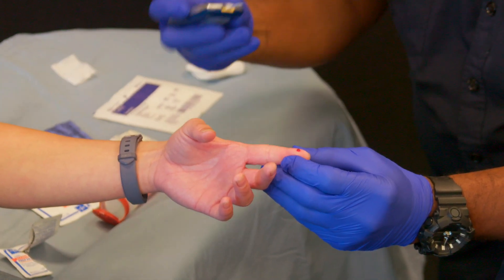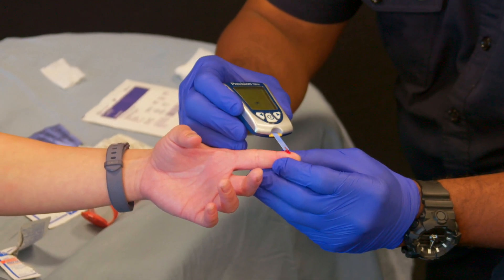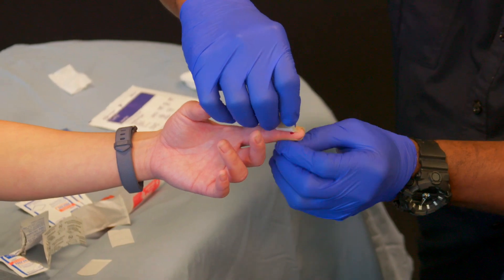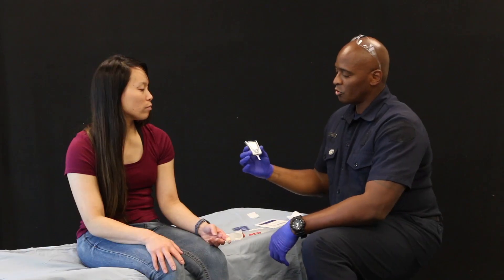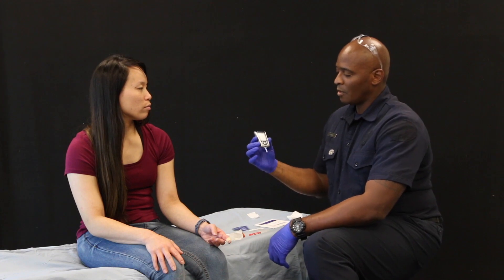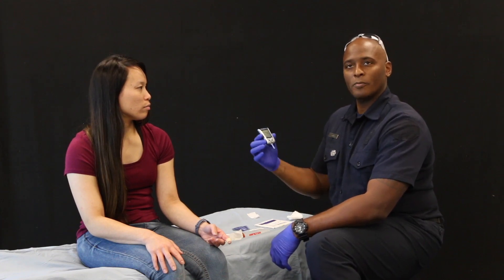Once a second blood drop is formed, I will apply the blood to the glucometer test strip. While the glucometer processes, I'll apply the adhesive bandage to the patient's finger and make sure to place the lancet in a sharps container. I'm going to note the reading on my glucometer, and based on that reading, I'm going to decide if there are any interventions I need to make within my scope before the paramedics arrive.